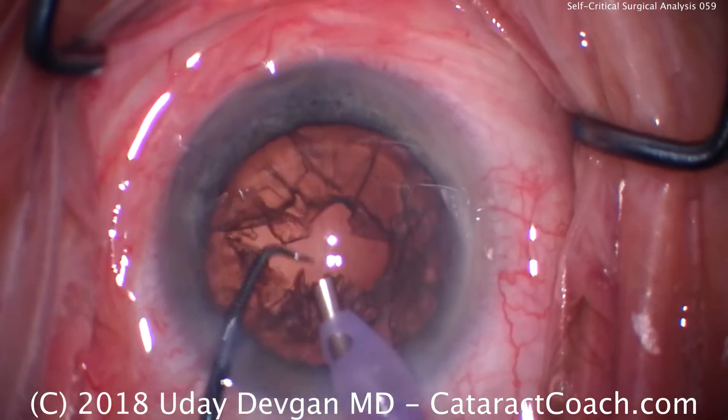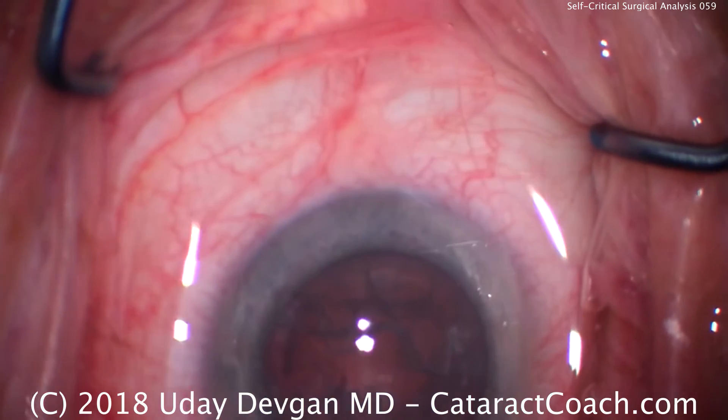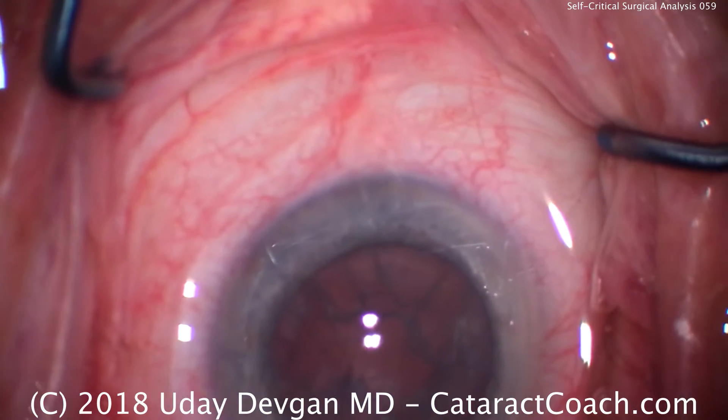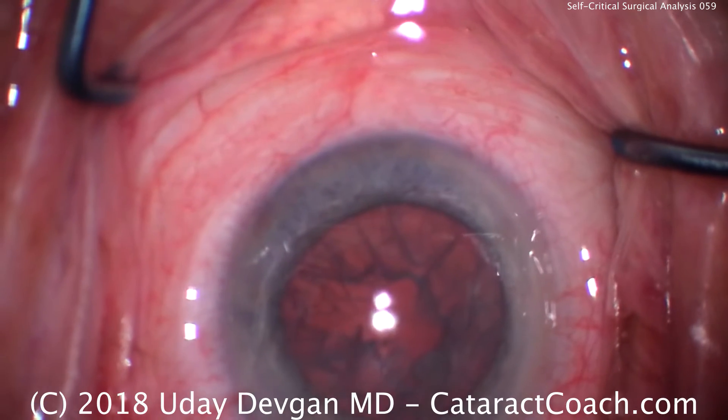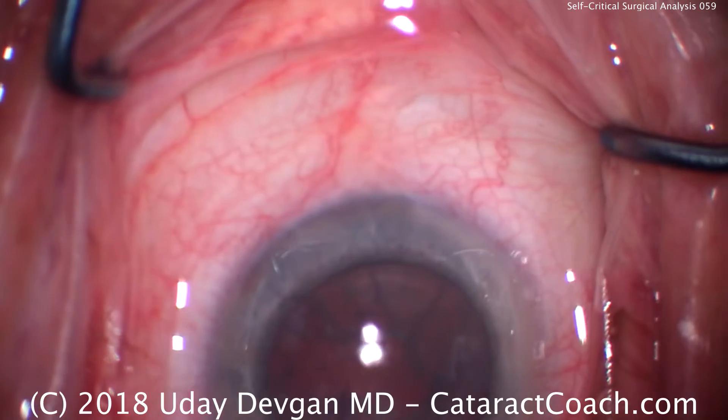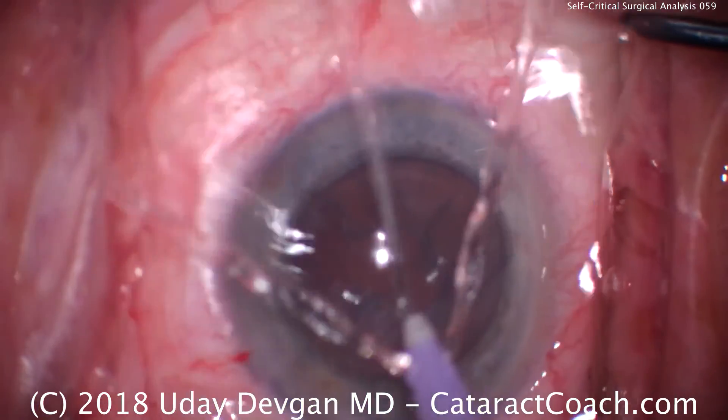Lots of reflections from the microscope lights off the conjunctiva. And now there's a big epinuclear shell — so our hydrodissection was actually a hydrodelineation. Now we're stuck with this big thick epinuclear shell. Certainly we'll get it out, but it makes for a less efficient procedure.